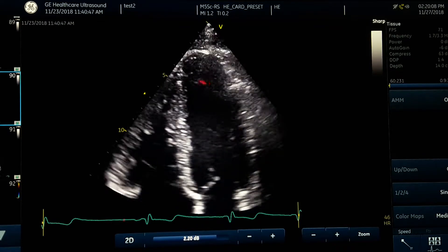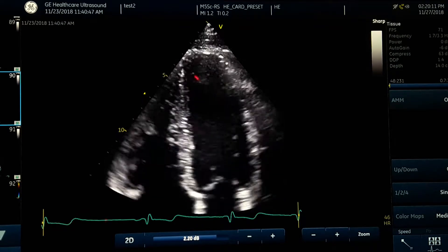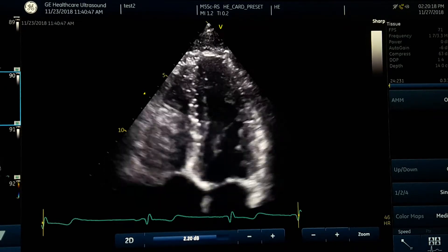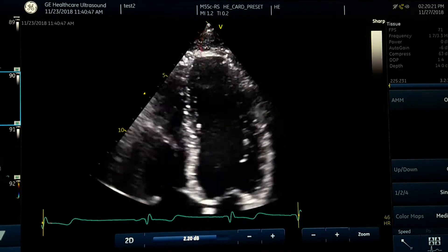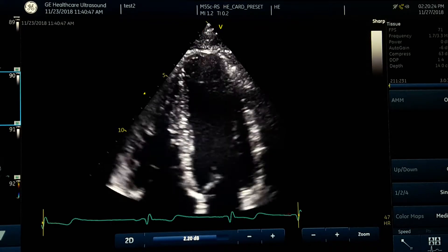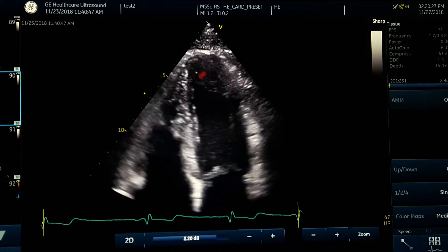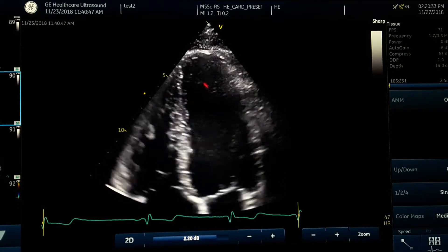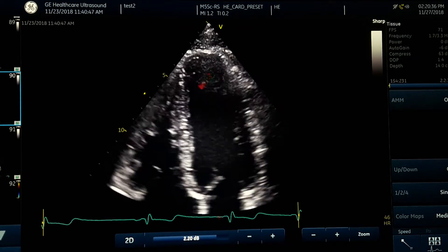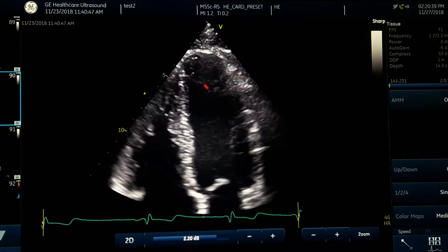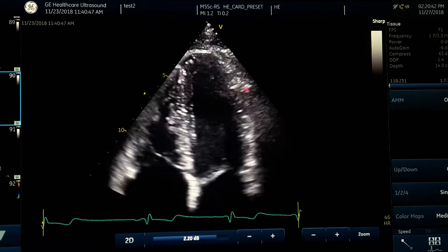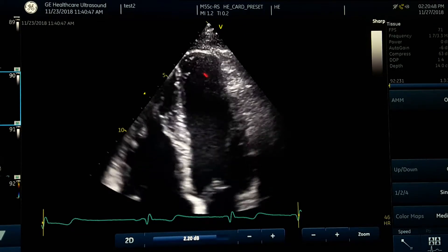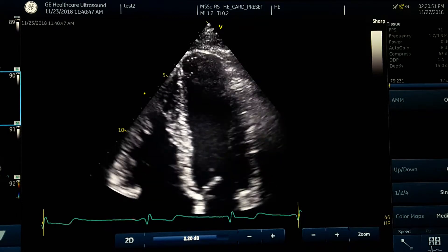As you can see on this image, there is a little artifact or echogenicity and a line here. You want to determine whether this echogenicity and line is an artifact — usually a near-field artifact or reverberation — or whether there is truly a thrombosis or mass present. If there is a thrombosis, the echogenicity should move with the heart; as you see here, it doesn't move — it is fixed, and even with patient breathing it goes left and right. This hyperechoic line and structure remains almost fixed.